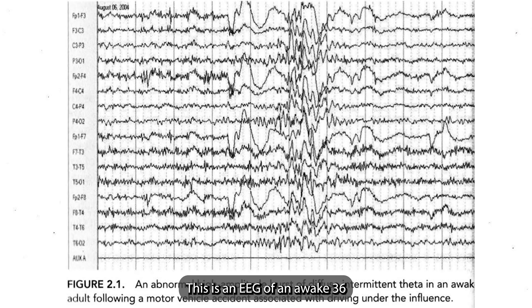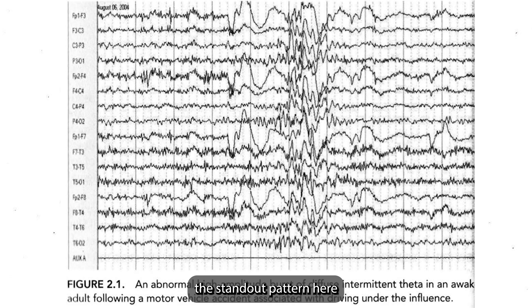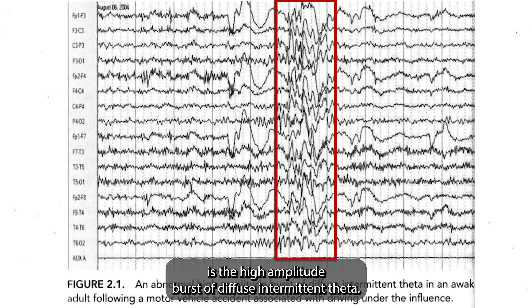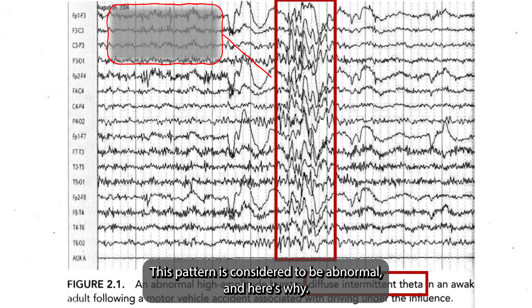This is an EEG of an awake 36-year-old adult following a motor vehicle accident. The standout pattern here is the high amplitude burst of diffuse intermittent theta. This pattern is considered to be abnormal, and here's why.